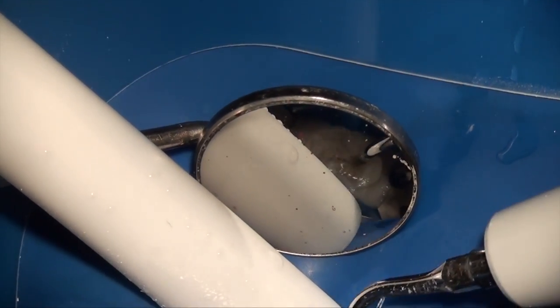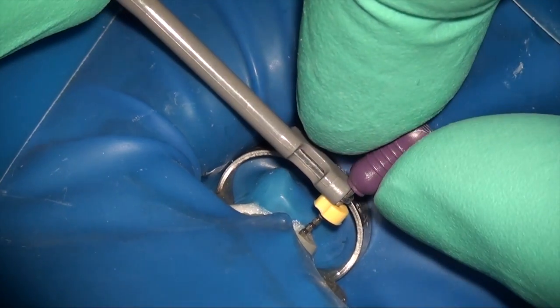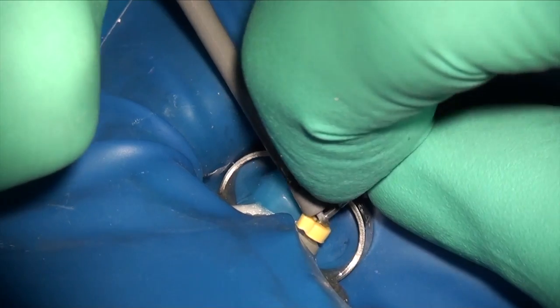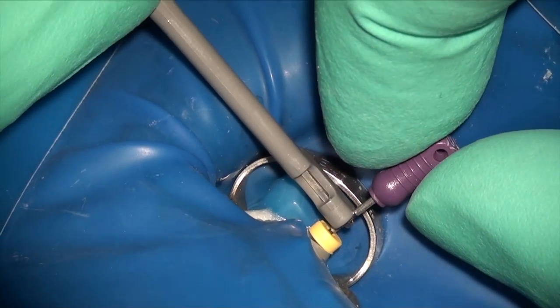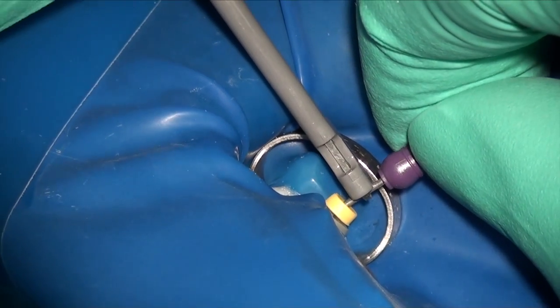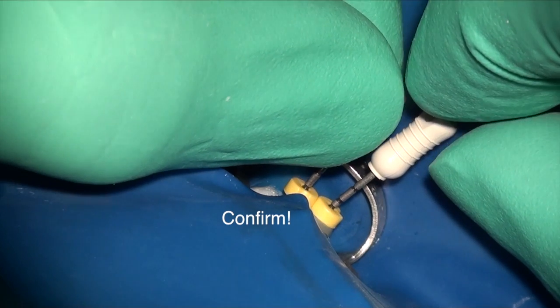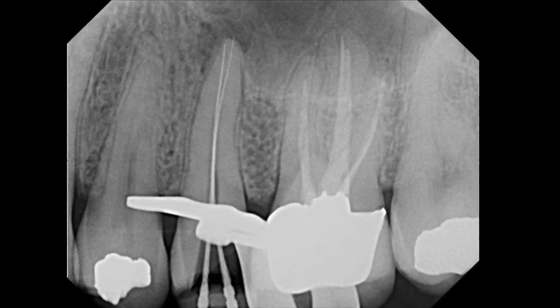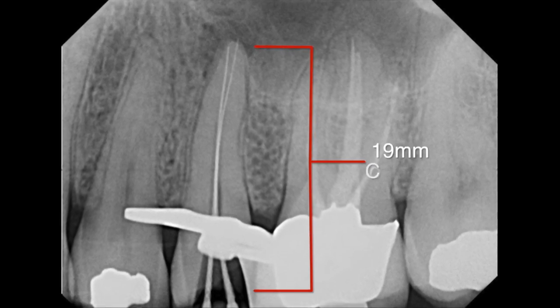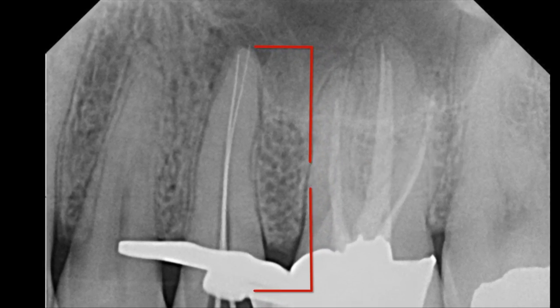I always follow my orifice opener with the use of ultrasonic and water, which removes the debris that's been cut efficiently. Now I'm going to use a number 10 hand file to determine the working length, and I'm using the apex locator, and then I put both files in there and expose a radiograph to confirm those lengths. It's very important to confirm your lengths from your apex locator, because as here you can see, you get the additional information that you have two files that do not join and you have two separate canals.